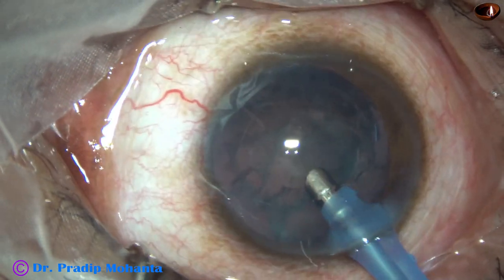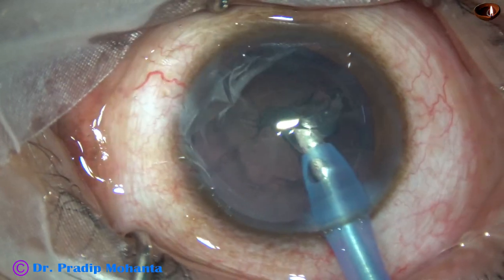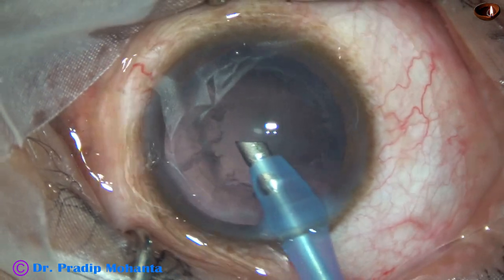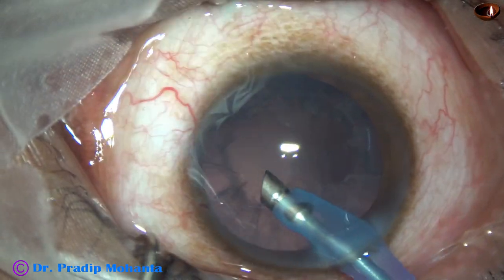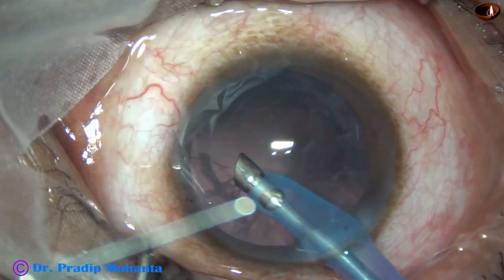For the last part, I go to phaco3 mode — epinucleus mode — and remove this part. And now I try to remove a small portion of the cortex by the phaco needle itself.